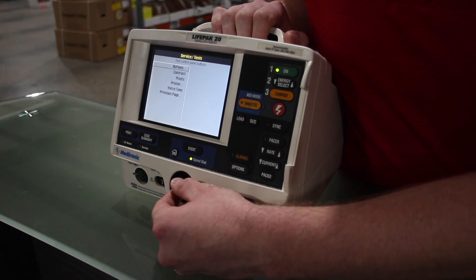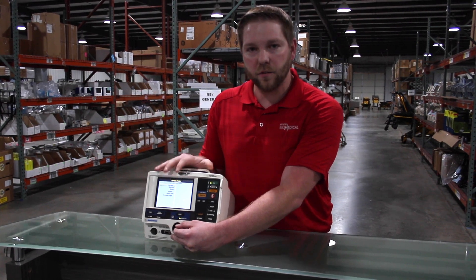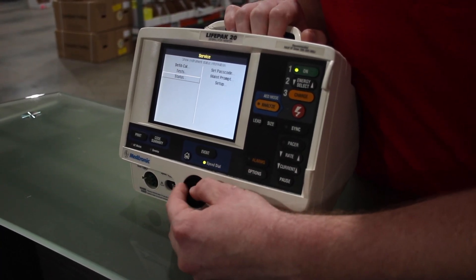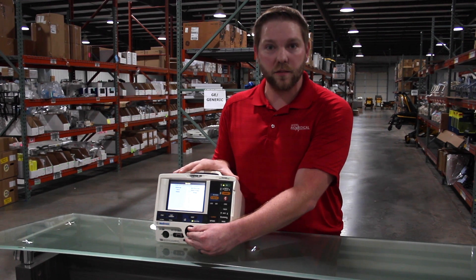Under this screen is where you can test all your buttons, your printer, your speaker, and verify that your LCD screen is functioning properly. Under this mode is where you can also go to maintenance prompt. Under maintenance prompt, you can tell your machine when to alert the user that it is due for your next calibration and PM.